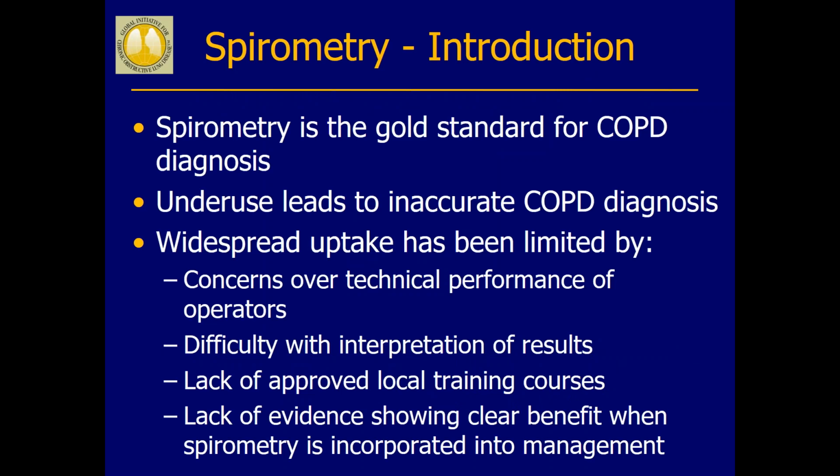It's also the standard for asthma as well, but for the slide deck, they will concentrate on COPD. Underuse of spirometry leads to inaccurate diagnosis of COPD and asthma, and widespread uptake has been limited by several things that I think everybody here understands. Concerns over technical performance of the operators, basically whether the people actually doing the spirometry on patients know what they're doing, difficulty with interpretation of results, whether the providers who interpret the results understand what the results mean, lack of approved local training courses, and lack of evidence showing clear benefit that spirometry is incorporated in management.